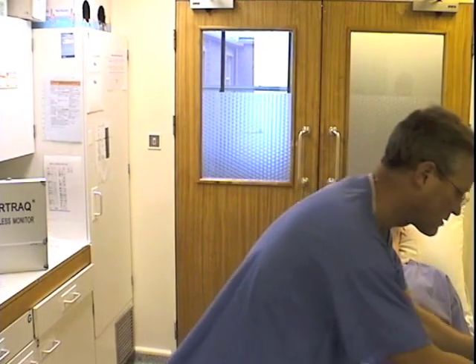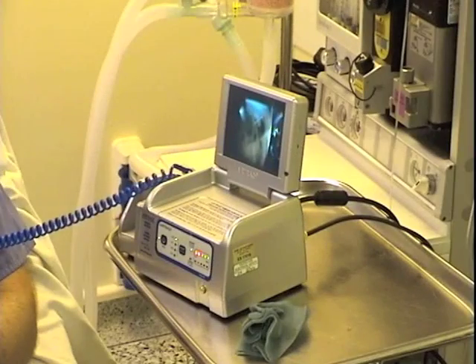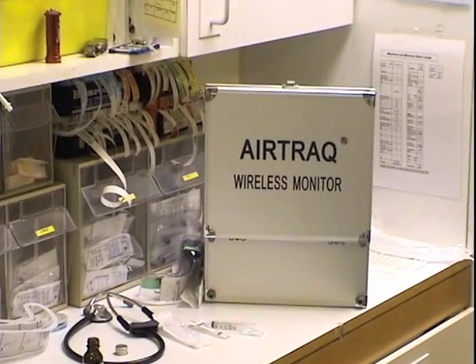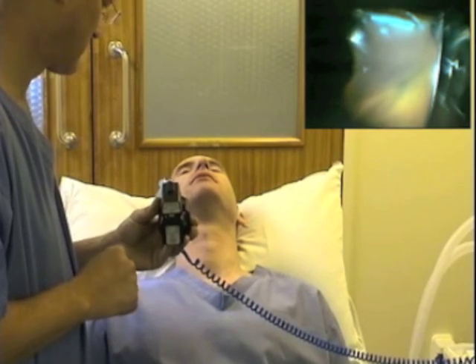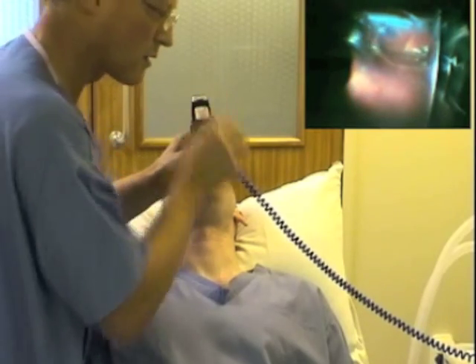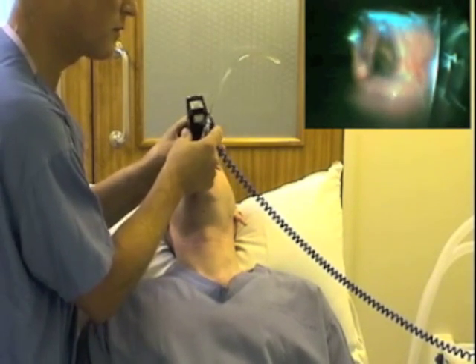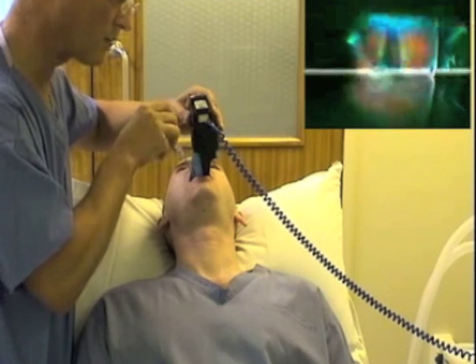You can actually have a look down with the Airtrack and see when it fills up. I'll just lubricate it a little bit more until it's fully lubricated. There's the larynx coming into view. I'm just going to spray the larynx by passing it down — that's my view — and then spray it.